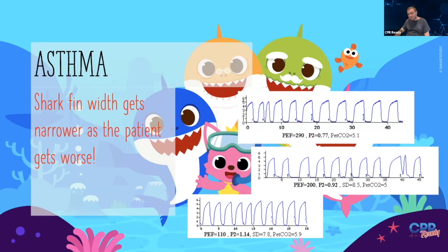So don't just say, oh yeah, that's a shark fin, great, that's asthma, I know what to do with it. Continuously reassess this patient. And this is going to help guide you as to what direction they're going. Are they getting better or are they getting worse?